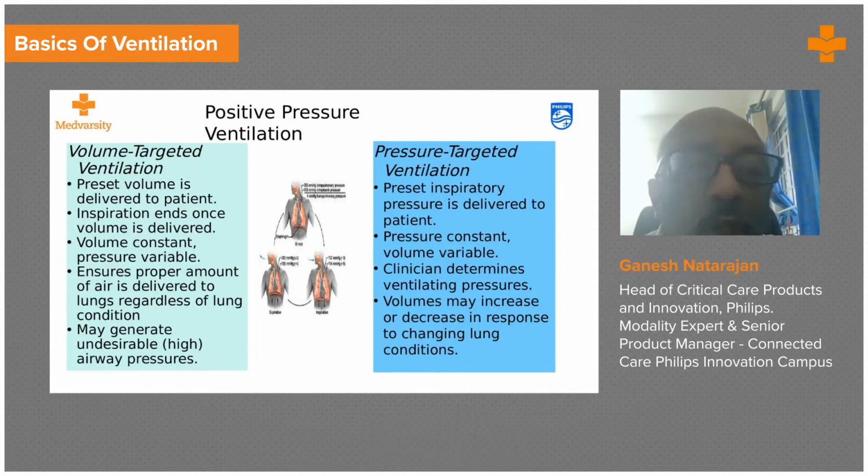Yeah. So in a volume targeted ventilation, the preset volume is delivered to the patient.